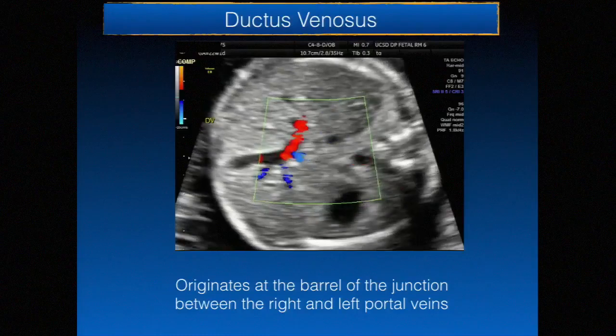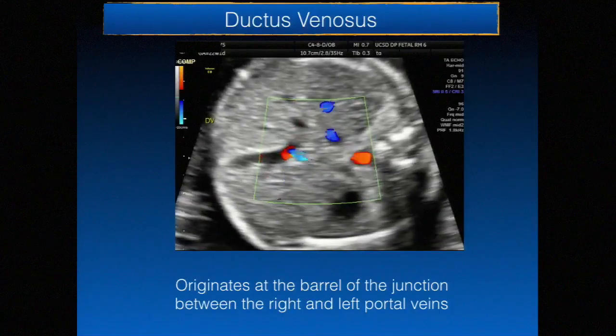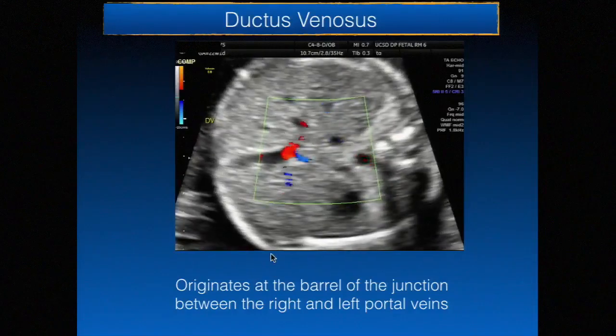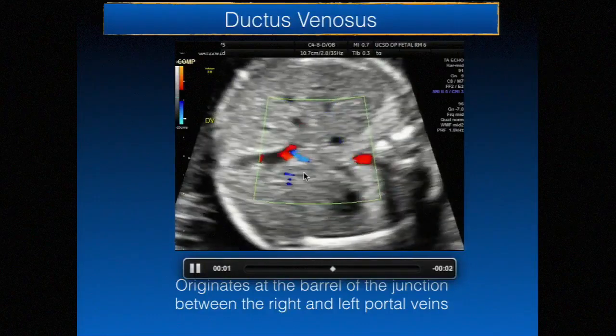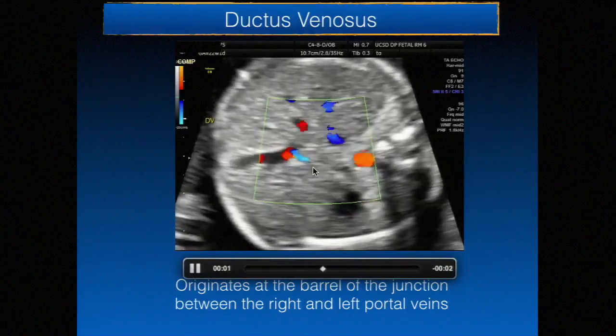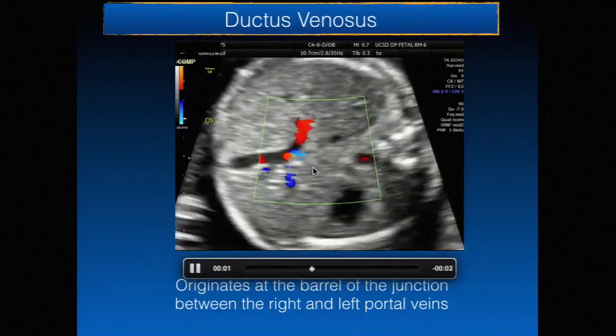Your ductus venosus Doppler does take a little bit of extra effort to learn how to do this quickly, particularly for the pediatric sonographers who aren't as familiar with this. But again, just being very familiar with the normal location. You can use the turbulence as a guide as well, but in cases where I've had absence of the ductus venosus that hasn't been draining directly into the IVC, or I don't have right heart enlargement, sometimes it's not there and there's an intrahepatic connection, so you might not see clues to that. So feeling very comfortable with the location, so that when there is absence of the ductus venosus, you can say it with confidence because you know where it should be.